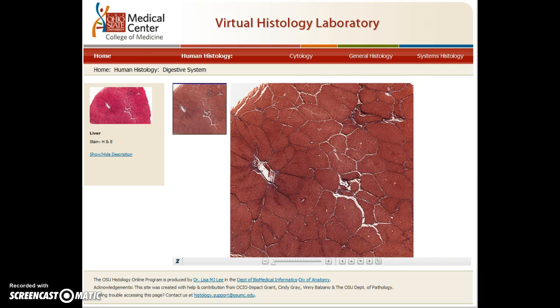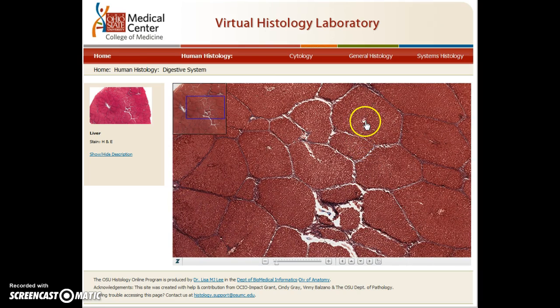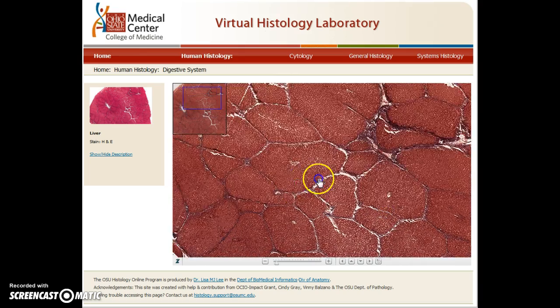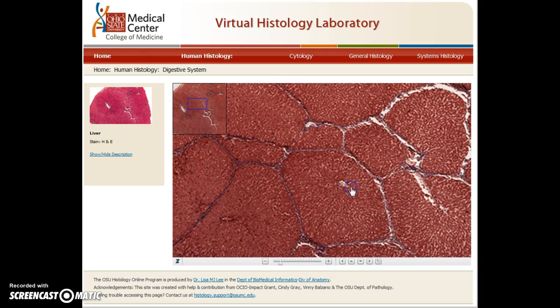For the liver, this is the first accessory organ of the lower digestive tract. And remember I said that the cells are arranged in lobules. You can kind of see in this stain here how they're in lobules. And at the center of each lobule, I said there was a central vein. So kind of this hole or this circle in the center here is the central vein.